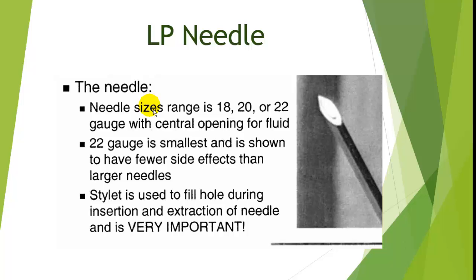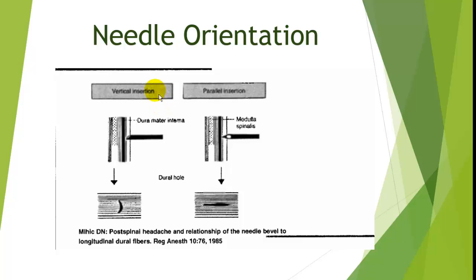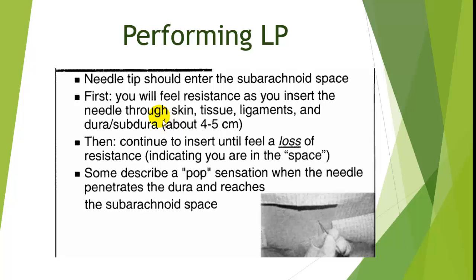The needle is a 22 gauge needle, and when it's introduced, the stylet must be in place. And again, it's inserted so that the needle is perpendicular to the dural fibers so as to hopefully reduce the risk of a post-LP headache. So you put the needle in.